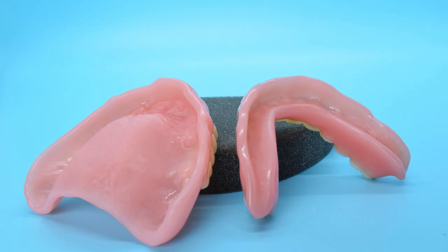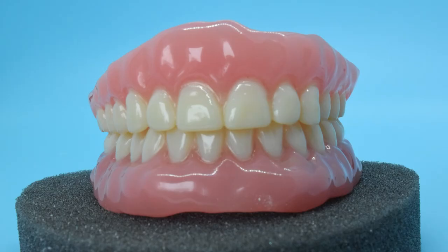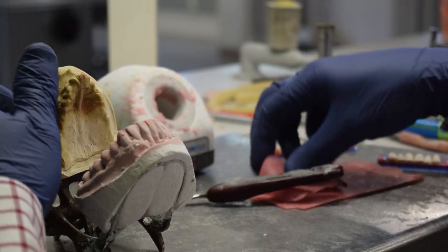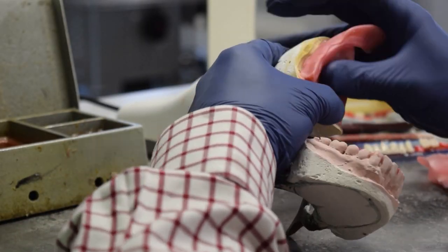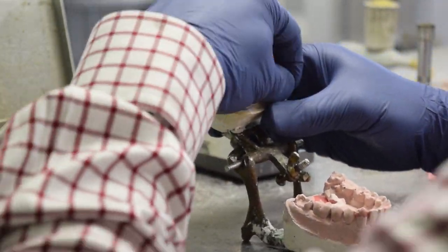Full Acrylic Dentures traditionally made at Utica Dental Lab. Once stone models are poured from your impressions and the lab receives an articulated bite block from the dentist, your dentures can begin to take shape.